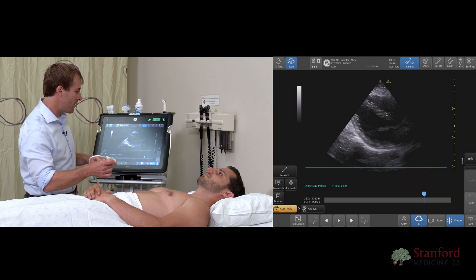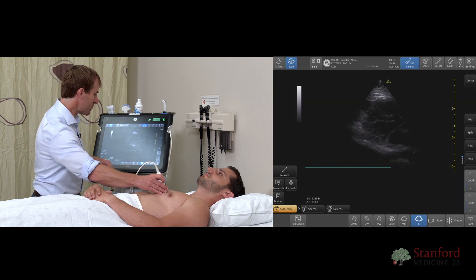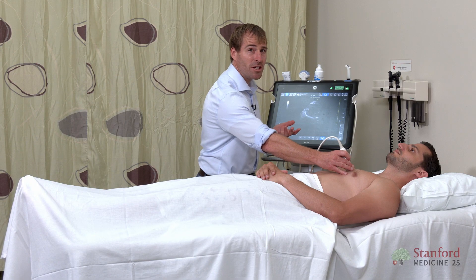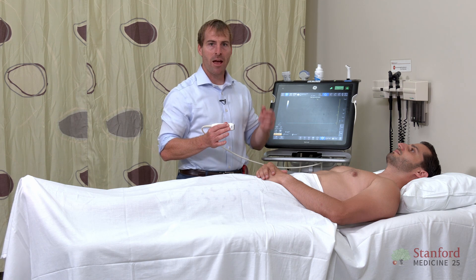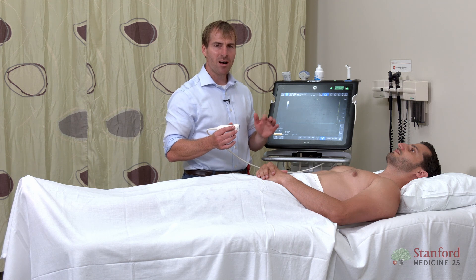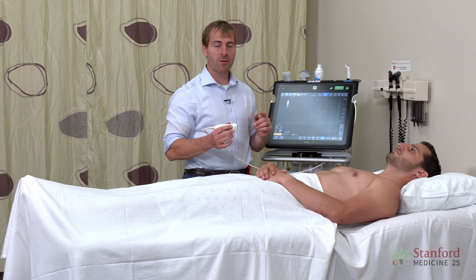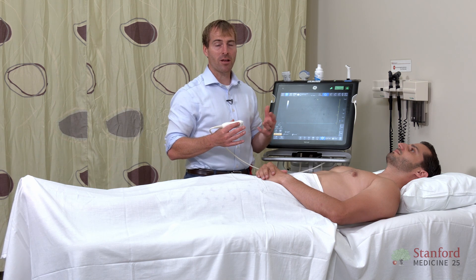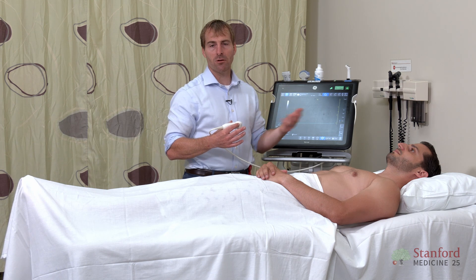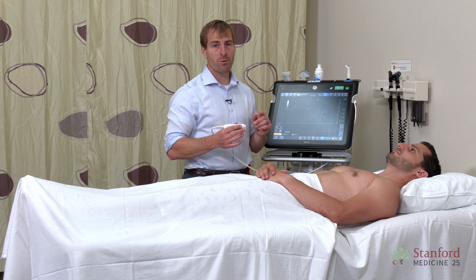The last thing I want to show you is how to record a video. On this machine, there's a little video camera icon — I just click that and it goes ahead and records a video clip. For most machines, it's preset to a three to five second clip; every time you hit it, it's going to grab another three to five second clip. Some machines act more like the camera on your phone where you hit the button and it'll just keep recording until you hit stop, but most will just grab a quick loop. That's going to be really important as a point-of-care ultrasonographer. We're much better at looking at videos because that's usually how we're doing this in real time. I tell trainees to go grab video loops that we can review together — it's usually much more useful than still images, though still images are important for when you want to take measurements.